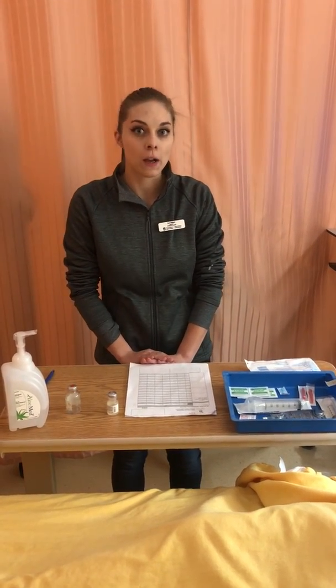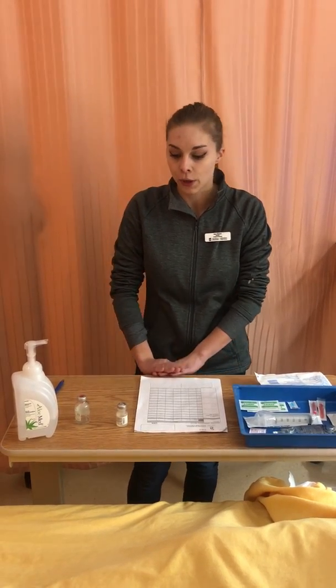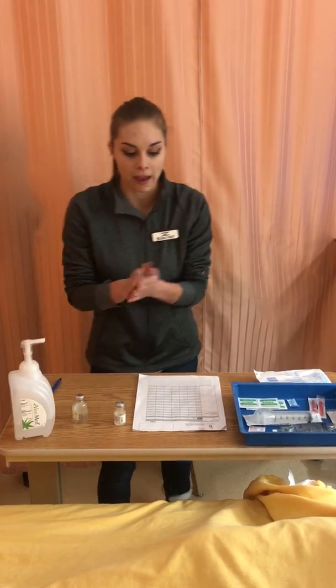Hi there, I'm Kara. I'm a student nurse here at the University of Manitoba, and today I am going to be demonstrating how to reconstitute a medication, dilute it, and administer it via the CIVA pump IV route. So the first thing I'm going to do is perform some hand hygiene.